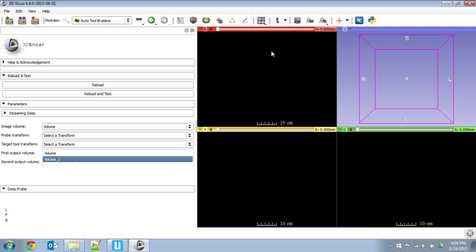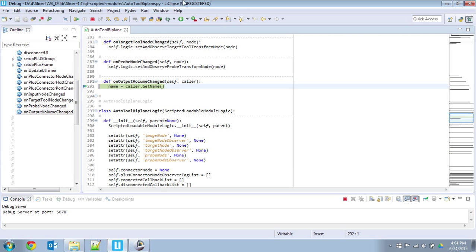And it looks like Slicer is hung. Okay, so you can't hear it. Oh, okay, there we go. So Slicer is quote-unquote hung. Because in LiClipse, we have a little blue arrow here. I hope you can see it. So this indicates that we are now paused in debugging. So this is great. So we can inspect the variables.